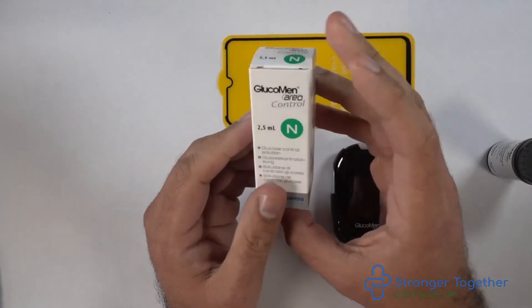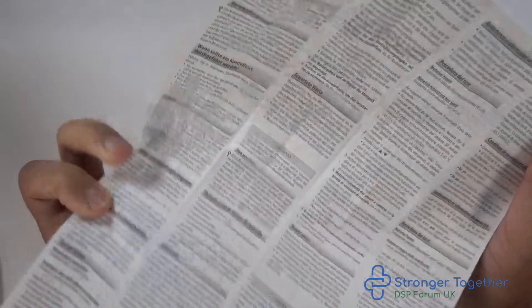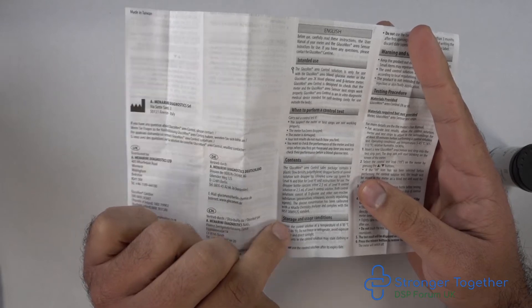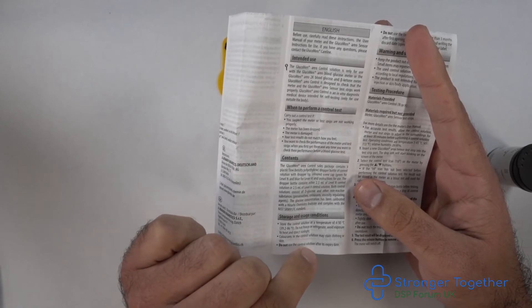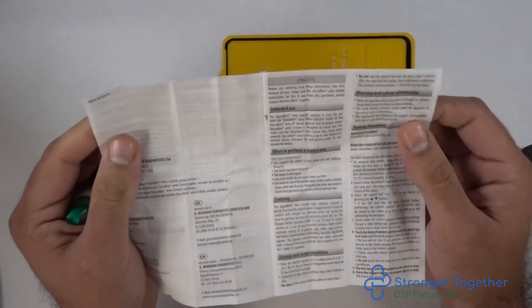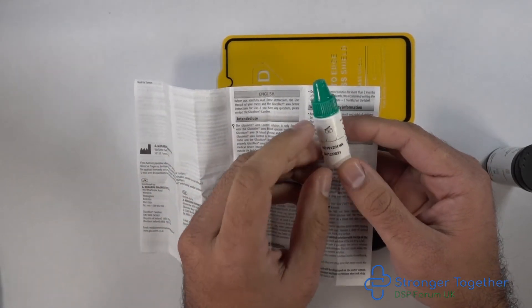Here we have our control solution — check the expiry date and ensure it is for our Aereo machine. Inside there is a detailed instruction leaflet which I would advise everyone to read. The main points are that the solution should be stored between 4 and 30 degrees Celsius, do not refrigerate, keep out of direct sunlight, and do not use after the expiry date. Also remember not to use it more than three months after first opening — write the date on the side of the bottle when you first open it.